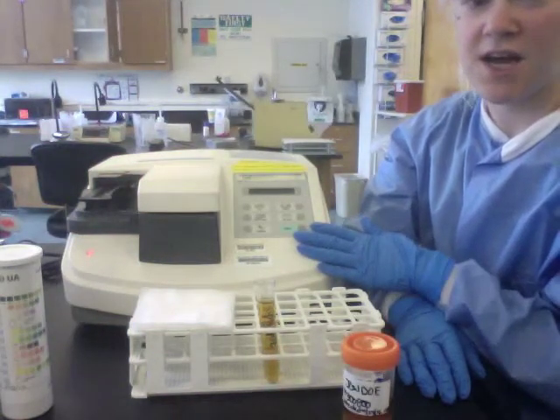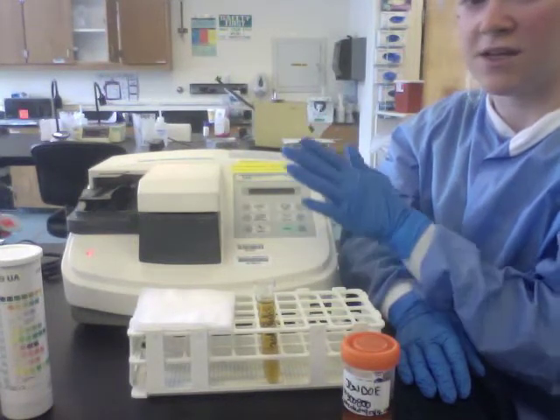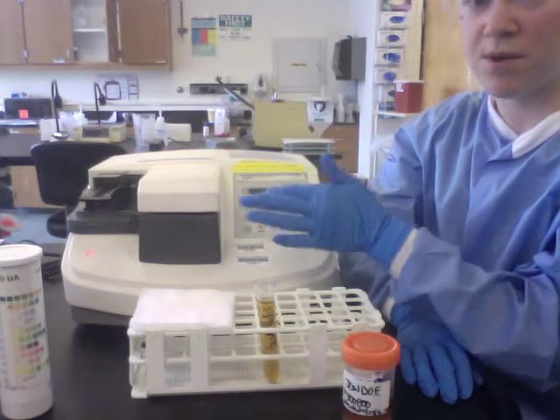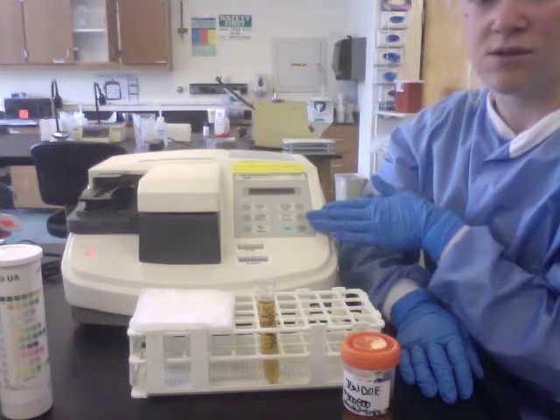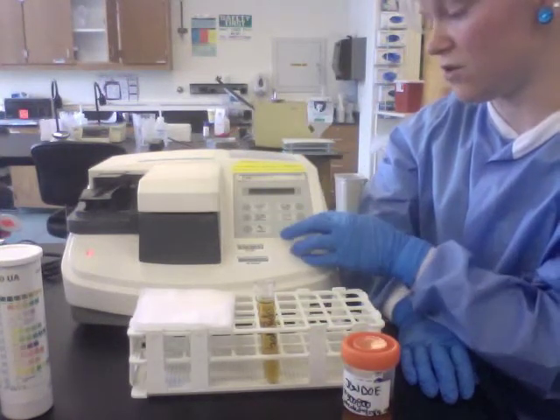This analyzer is timed, so you have to press the Start button and then dip your strip. It's very important that you dip your strip in time with the instrument so that the timed reactions are correct for your strip.